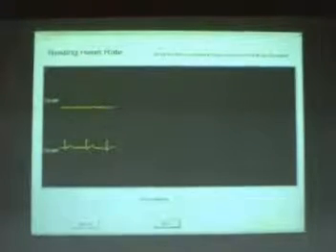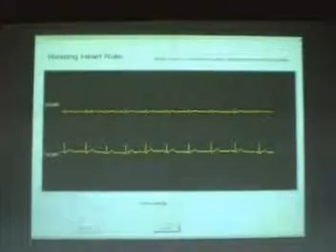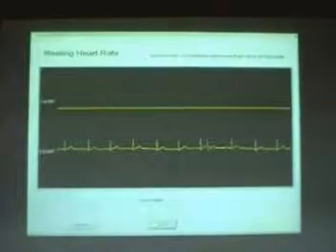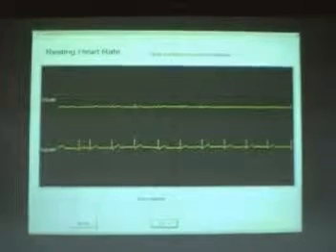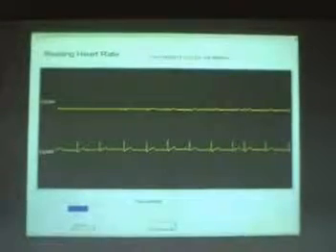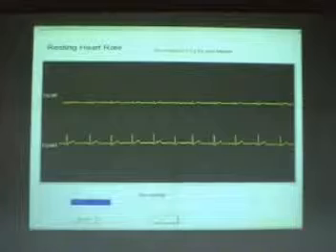Now this is the resting heart rate being obtained from the patient after connecting the ECG leads. Now we wait for the consistent rhythm and then we see. Once it is consistent, then we click on the record button. Yes, now we have pressed the recording button and the recording goes on. When it is complete, the entire beam becomes violet. That indicates the entire recording is over.